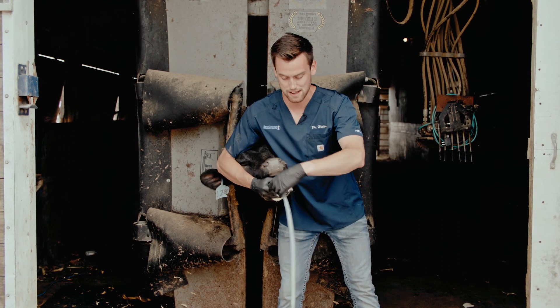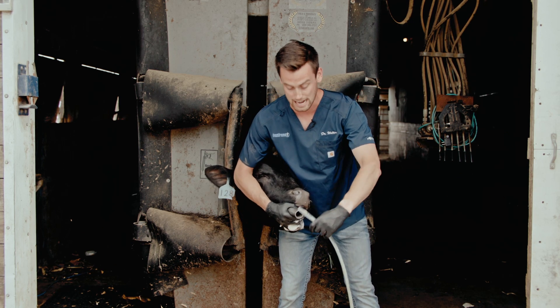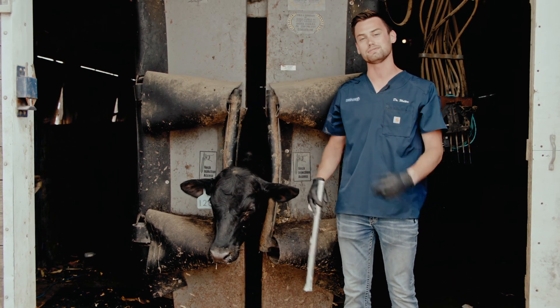As you can see, there is some stomach content in the tubing. Once the tube is completely out, it's safe to remove the speculum from the calf. And that is how you successfully tube a calf.